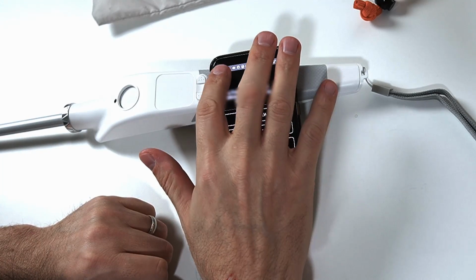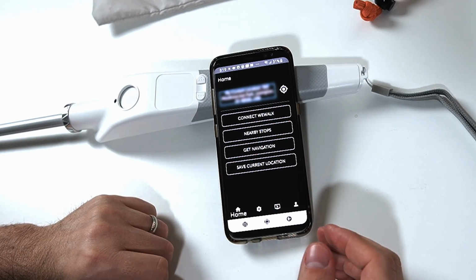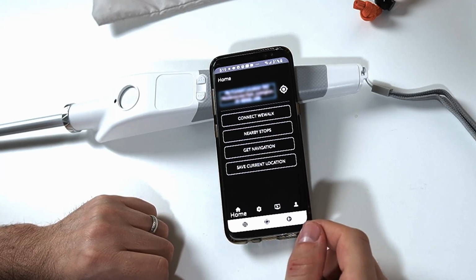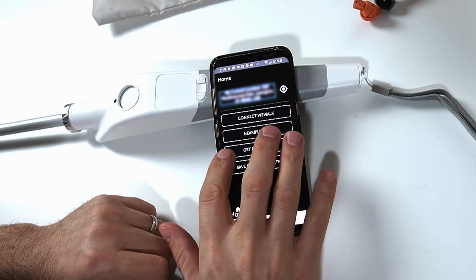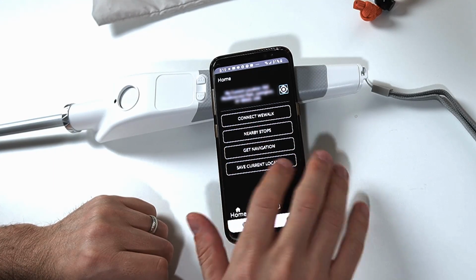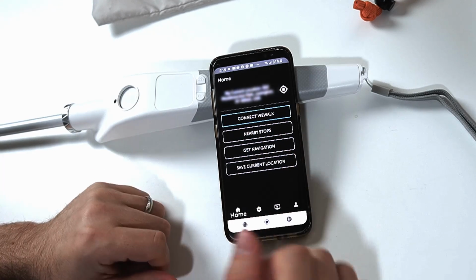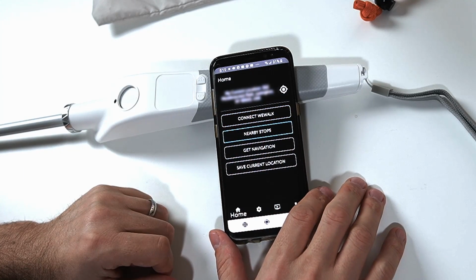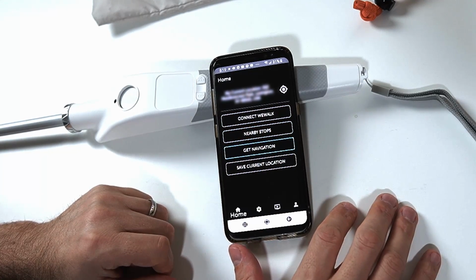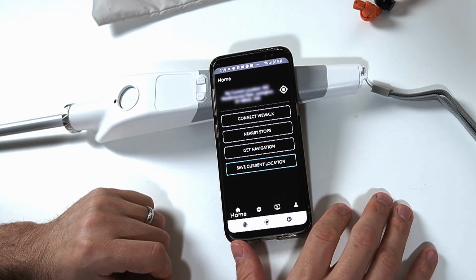So let's go through here. My current location. Okay, so it has my current location, and obviously I've got that blurred out, but you can refresh this. Refresh my location button. Connect WeWalk button. So we can connect the WeWalk cane, which we will do here in a second. Nearby stops button. Get navigation button. Save current location button. And you can save your current location.